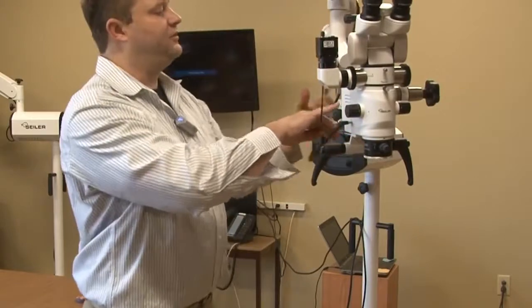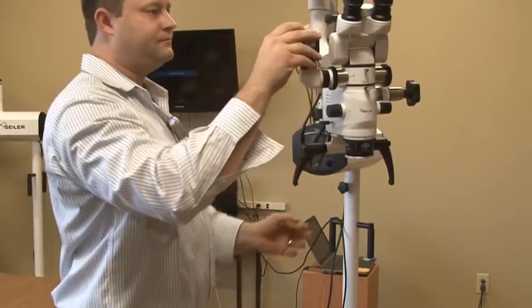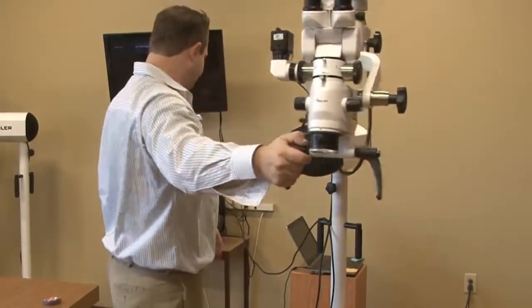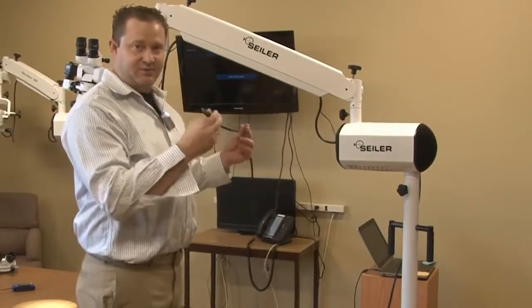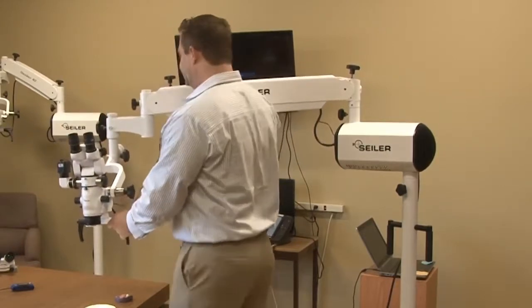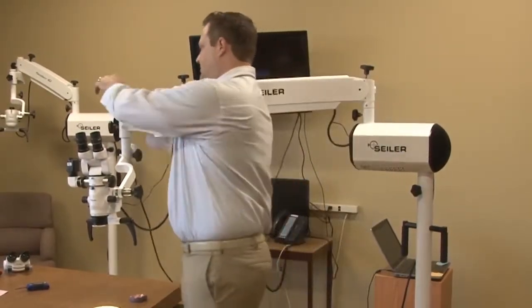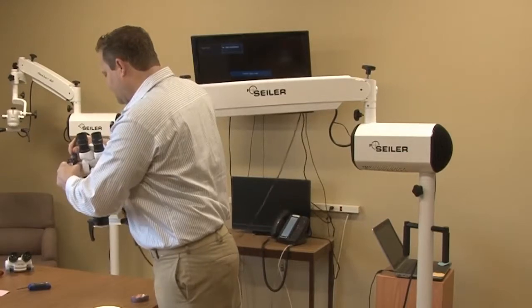Typically for cable management, what we do is we'll take some threads and clean it up a little bit. Now we want to turn on the microscope — we're going to have power to the camera. I'm going to have my HD cable. This is our HDMI, so any HDMI cable is going to work. We're going to have it plugged into the HD monitor, which I've already plugged in. This HDMI cable is going to plug directly into the camera.